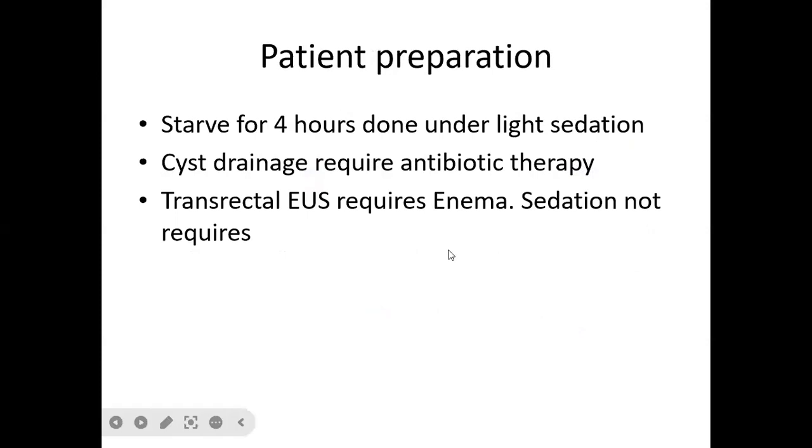So basically, in terms of patient preparation, we do endoscopic ultrasound under light sedation. How long it takes depends on what you are trying to do. For example, if you are inserting a stent, it may take longer. If you're just classifying a lesion, it usually takes less time. For drainage of cysts, we might need to put the patient on an antibiotic.